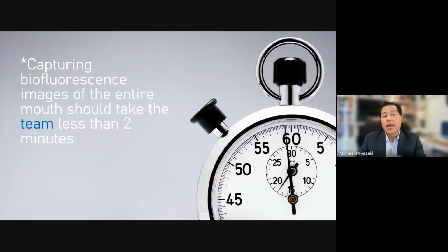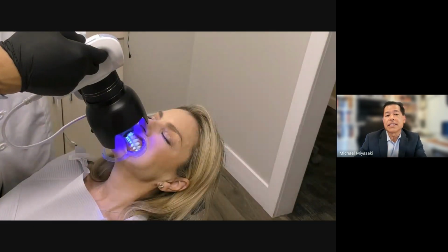And I will tell you, if you're already using the intraoral camera when you see your patients, whether it be for new patient exams, every exam, or every hygiene exam, it's not going to take you any longer. But if you're not using intraoral cameras and you start to use one to take images of areas of concern and to show them the red, it's going to take you less than a couple of minutes. It's not going to take very long at all, and it's going to be very easy to implement.